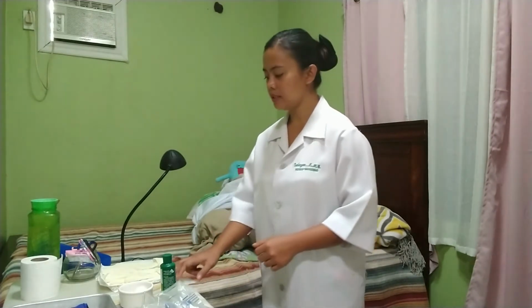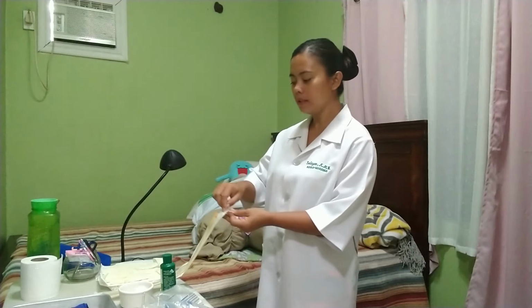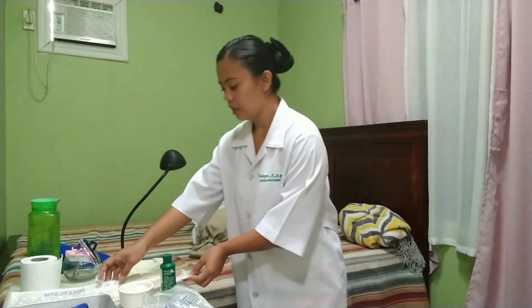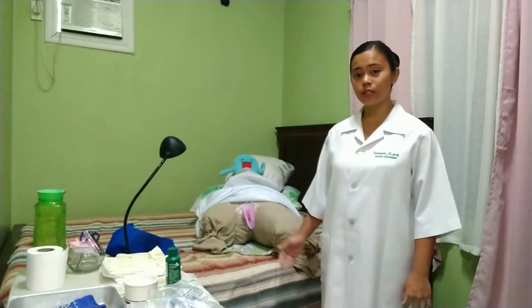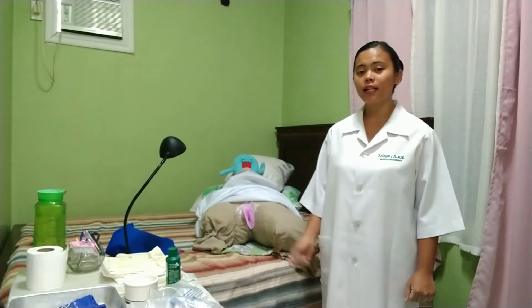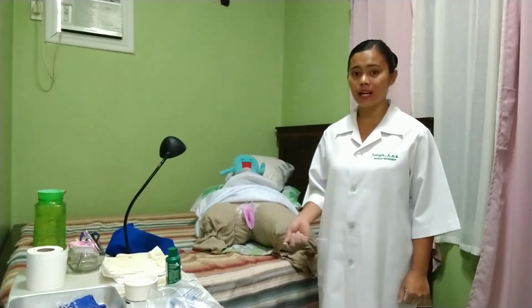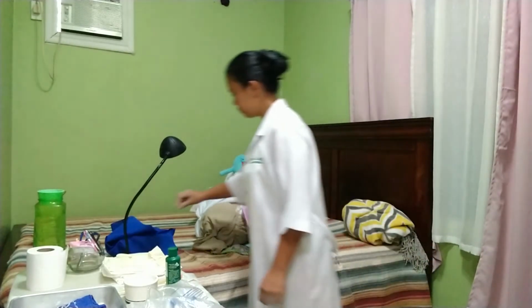Next is to open the Sterile Catheter Kit and place it on the bedside table. Make sure that you are not contaminating the inside since it is a sterile area. The next thing to do is to open our Sterile Catheter Kit, making sure that we are only touching the fold or the outside to protect the sterility of the center sterile field.